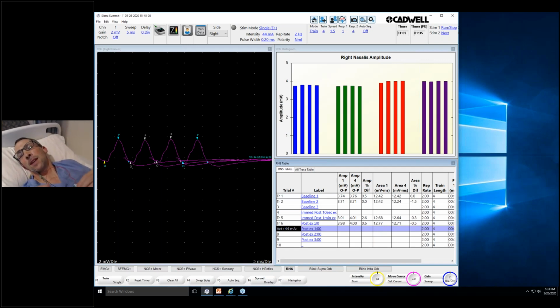But those are the main nerves we do. We also, if the patient has leg symptoms, may do the anterior tibialis or the peroneal EDB, although the yield of the EDB is probably lower; it's a very tiny muscle. It's sometimes atrophic. But we may do that. We rarely do the femoral, but certainly can. Some people will do radial rep stims, recording from EIP or the anconeus. Again, nothing wrong with doing those. I think the radial nerve is a tougher nerve to stimulate, and it may be hard to stabilize the arm from extending, so there are the same technical problems with that nerve.